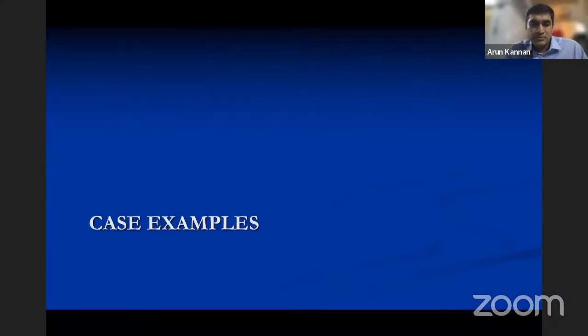Yeah. So, any points, Arun, for the sake of discussion? We completely agree with you that increasing the version of the stem can avoid both impingements. But with uncemented wedge tapered stems, which is what we are using right now, how much can we really manipulate the version? Most of the time, when we use the final broach for the press-fit stem, the inherent bone anatomy takes the version into account. So how much can you really change whenever you use a double wedge tapered stem?